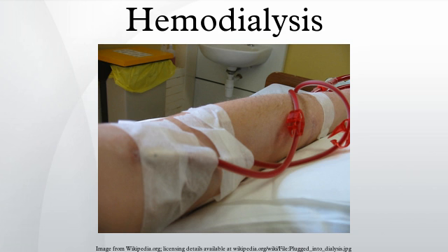The severity of these symptoms is usually proportionate to the amount and speed of fluid removal. However, the impact of a given amount or rate of fluid removal can vary greatly from person to person and day to day. These side effects can be avoided and/or their severity lessened by limiting fluid intake between treatments or increasing the dose of dialysis, for example dialyzing more often or longer per treatment than the standard 3 times a week, 3 to 4 hours per treatment schedule.